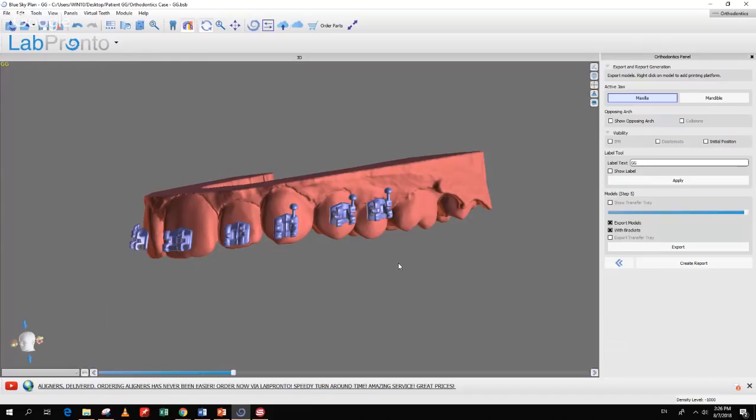The purpose of this webinar presentation was to show the process flow and how the functionality works. The next webinar presentation is going to go into a bit more detail about some of the more advanced functionality within the Ortho module.